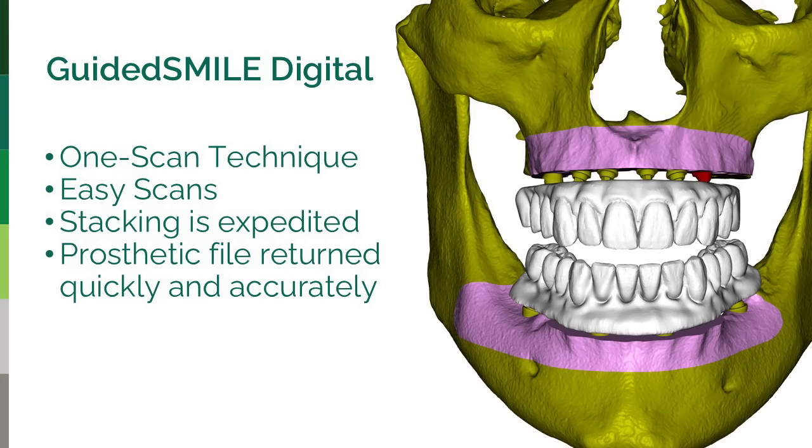So what do you get from it? One scan technique, easy scans. You have an expedited service because the stacking is so efficient, and you get a quick return of your prosthesis.